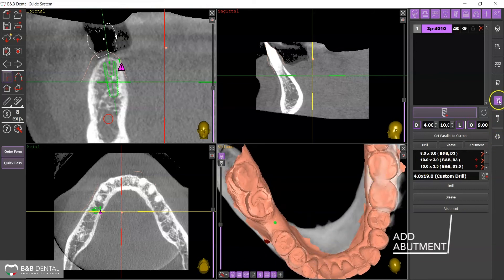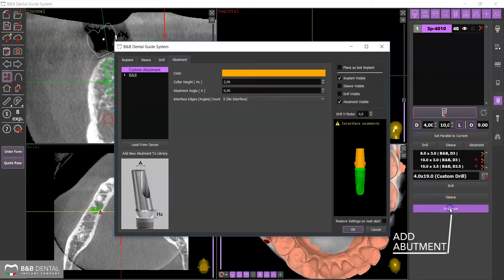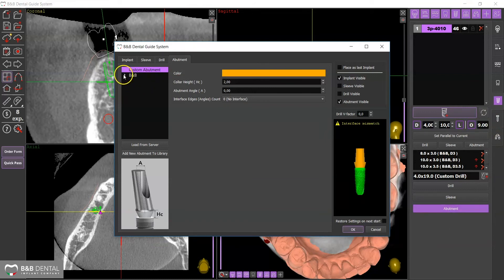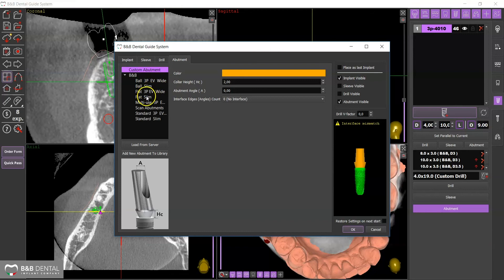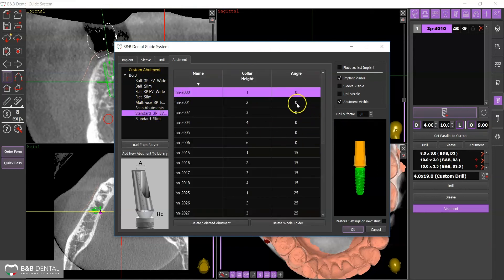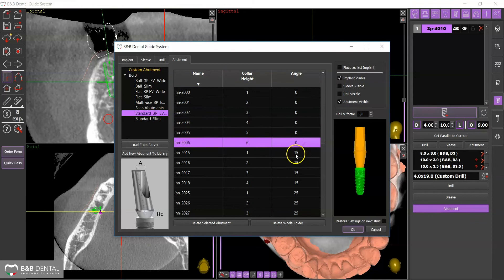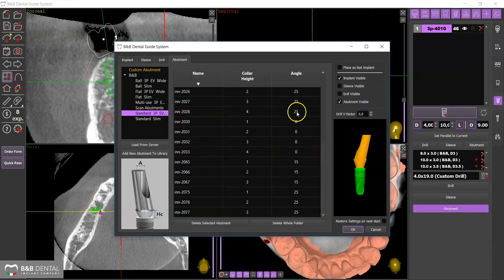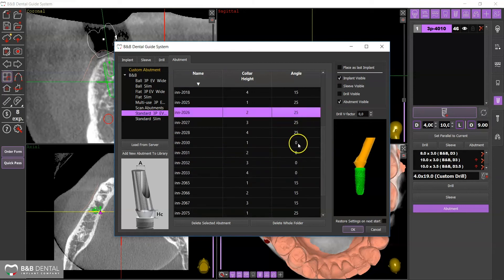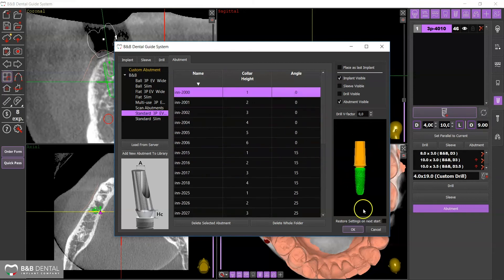By selecting Add Abutment, you can view and choose the type of aesthetic component on the panel by choosing from various inclinations and transmucosal heights. Once you have found the suitable abutments, click OK.